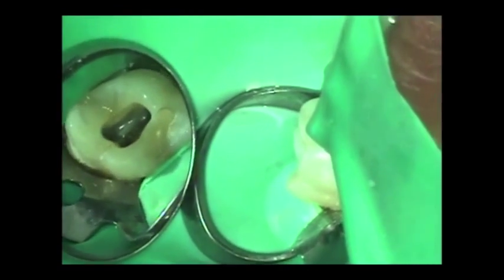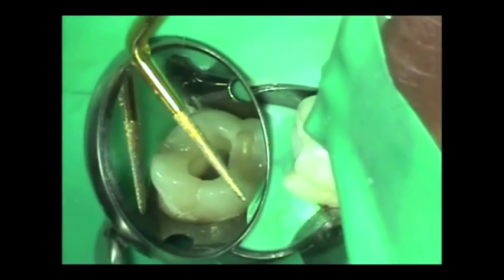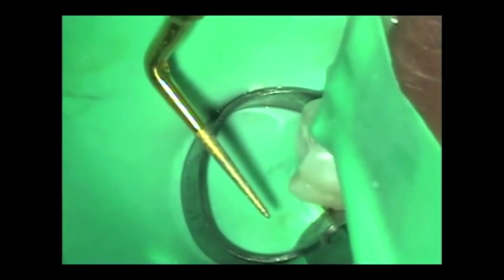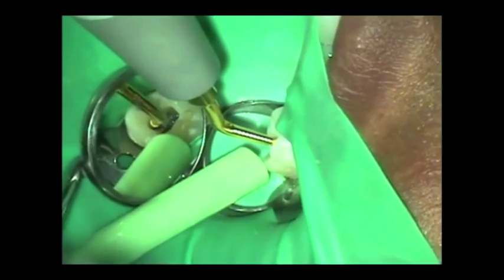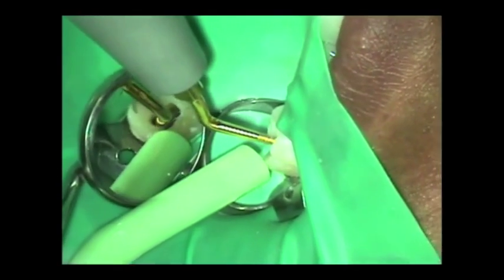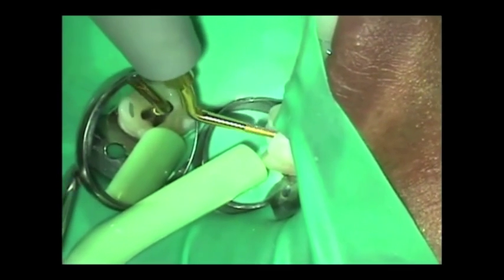So what I'm going to do is take my ultrasonic tip and we're going to go into the canal and just run along that embryological line between the MB and the palatal canal, and try to move that mesial wall all the way.